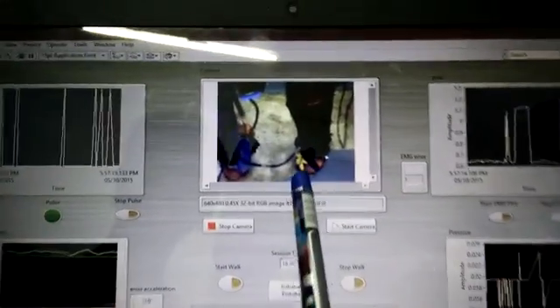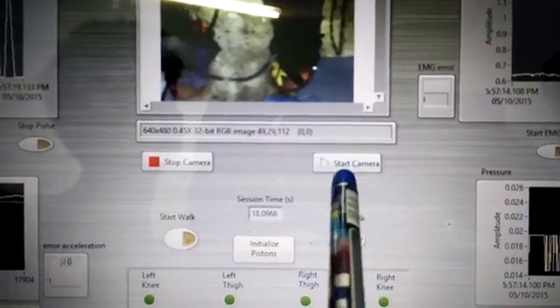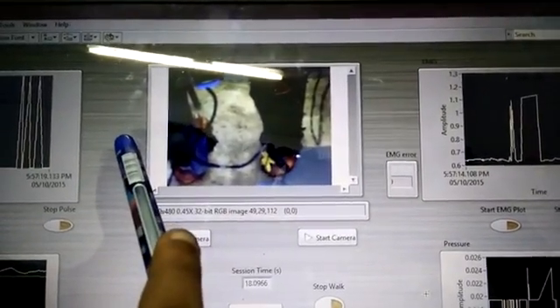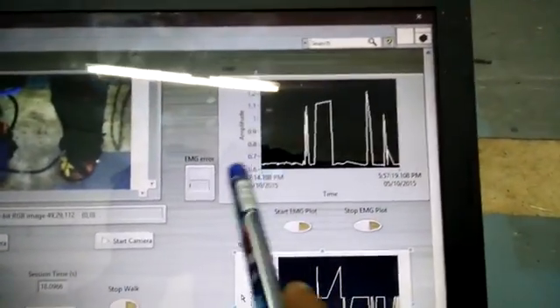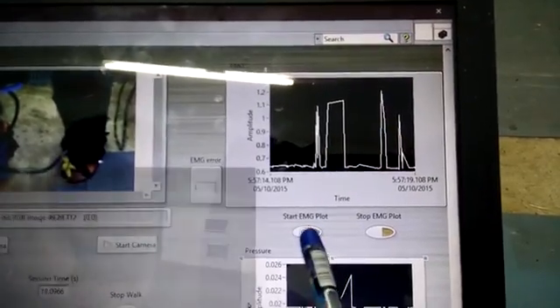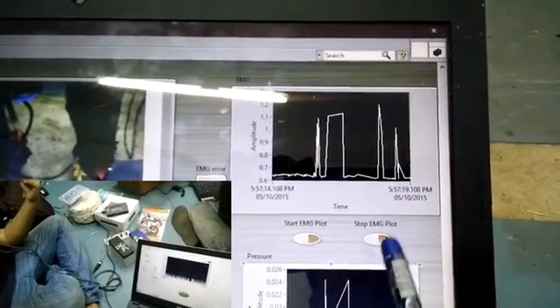The camera is mounted on the back of the exoskeleton and shows all four joints of the leg. There are two buttons for the camera: start camera and stop camera. Pressing start camera activates the webcam attached to the back of the exoskeleton. Moving on to the EMG section — the EMG sensor is attached to the leg of the patient using the exoskeleton. When EMG is started, the EMG graph is plotted in the waveform chart, and it can be stopped using the stop button.